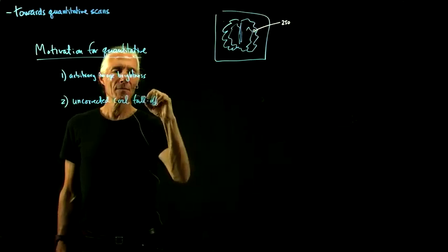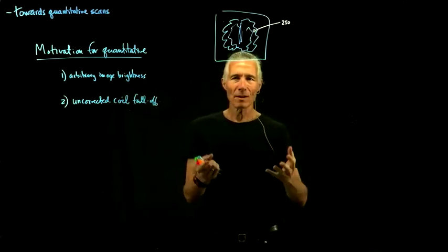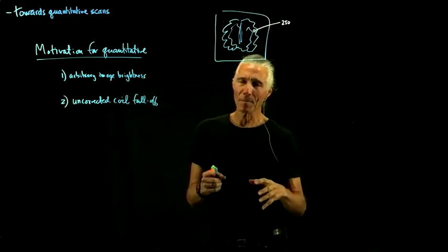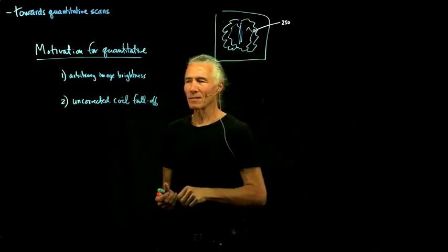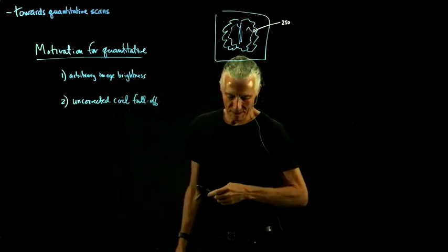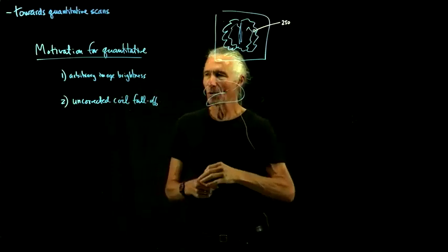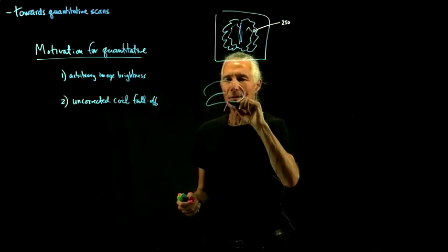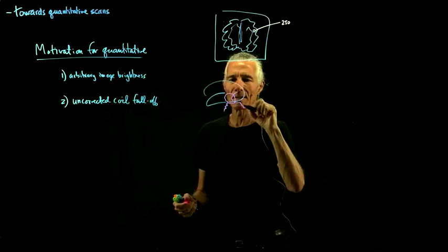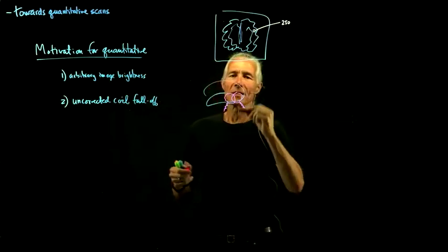Now, back in the day when we used to have 1 Tesla scanners and a quadrature head coil that was relatively big and kind of far away from the brain, this wasn't as much of a problem. But now we have setups with small coils, which might be only about that big. These small coils have several properties.